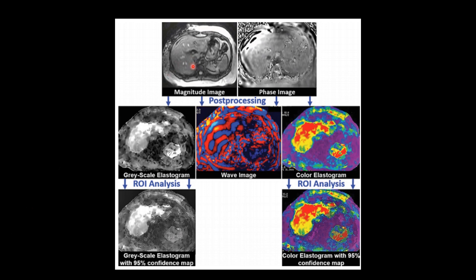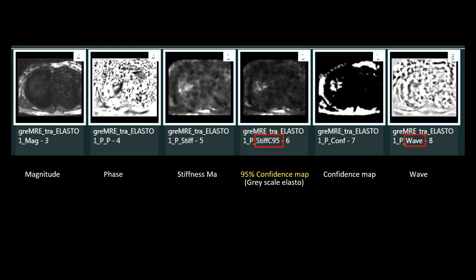We acquire images in the form of magnitude and phase images, which undergo post-processing steps and give us the main elastogram images: the wave image and the color elastogram. Over the color elastogram there is a 95% confidence map overlapped, which leaves out areas with artifacts and retains the liver parenchyma, so that we can draw a region of interest (ROI) over this and quantify liver stiffness. We also have wave images to assess the waves.